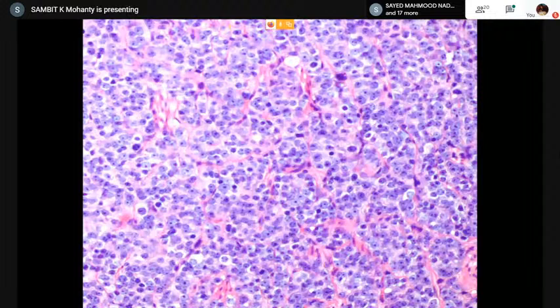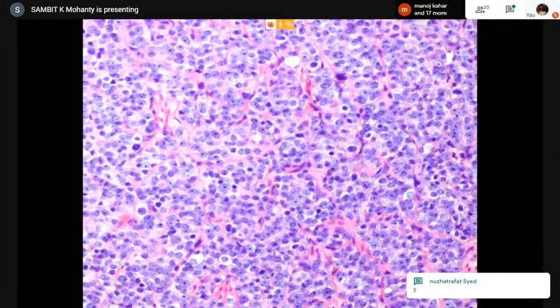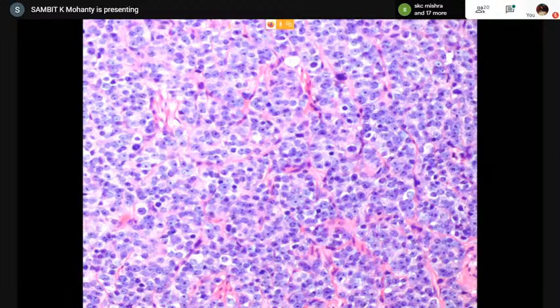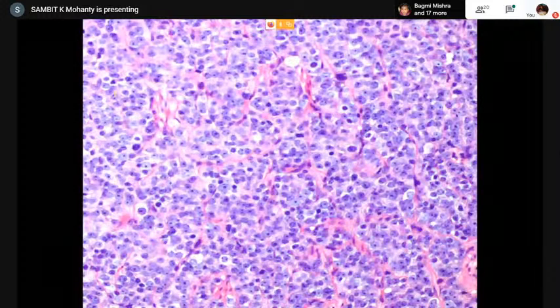This one? I have shown this slide a few lectures before. What is this one? This is again 5. Why is it not small cell carcinoma? You see very prominent nucleoli, and the nuclear membrane is perfectly round. There is no wrinkling and there is no molding, no fitting into the convexity or concavity of another cell. And prominent eosinophilic nucleoli. This is Gleason pattern 5.